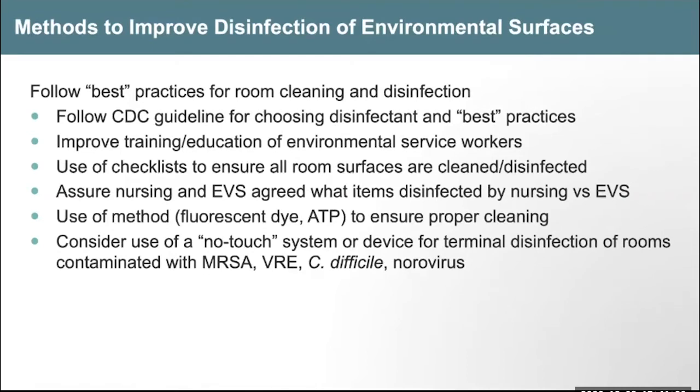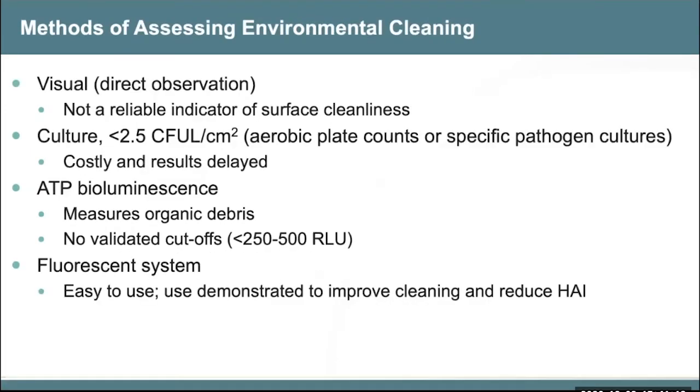You should assure proper cleaning. Measure disinfection with fluorescent dye or ATP. We prefer fluorescent dye. And ideally, for significant pathogens, we believe you should follow your chemical disinfection with a no-touch system for terminal disinfection. I'll talk more about that later, and we do that at my hospital.